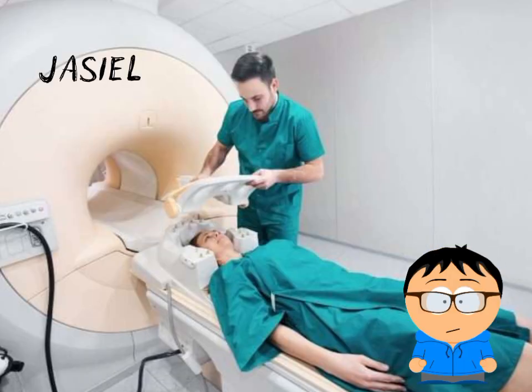Magnetic resonance imaging is an advanced device that uses a magnetic field and radio waves to create images of organs and tissues inside the body. Unlike other imaging devices that use radiation, magnetic resonance imaging is non-invasive and does not expose patients to ionizing radiation.